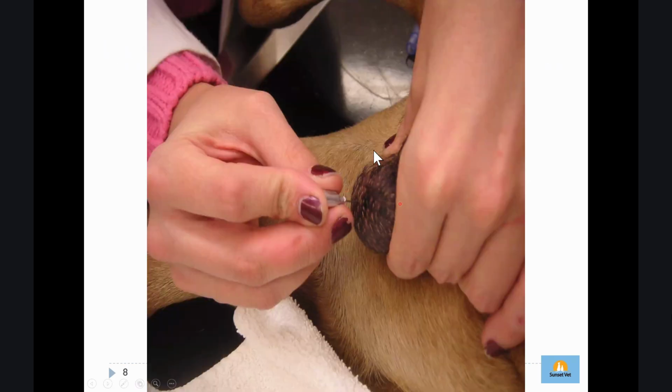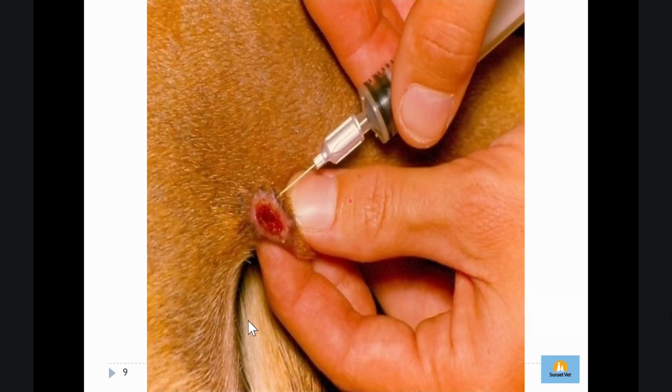So literally, this is the mass. You prepare the needle. Let's say this is my finger, it's the needle, and then you sneak it in like this, and then do like this around the lump area. So at least you will get everything from it. It's the same also with this one. Literally, if you want to use the syringe, it's good also.